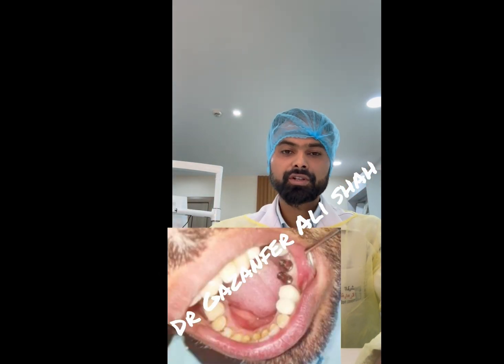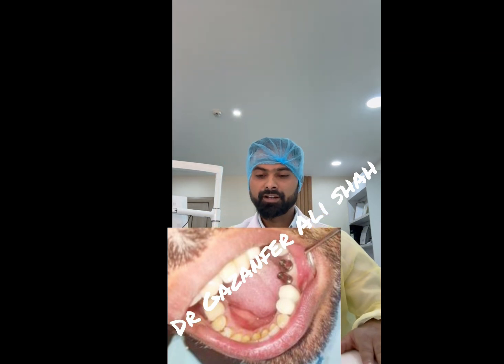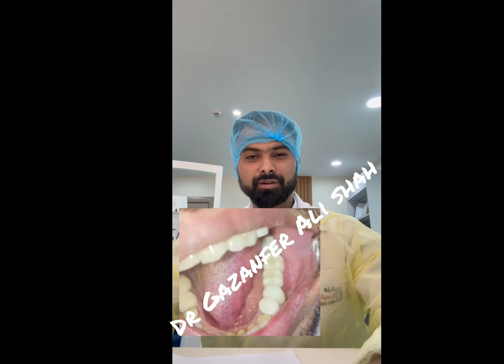After that, we are using abutments to check height and angulation, and we're taking impressions and sending them to the lab. The final prosthesis is ready. We are fixing the final prosthesis. You can evaluate the pre-op and post-op pictures of the patient.